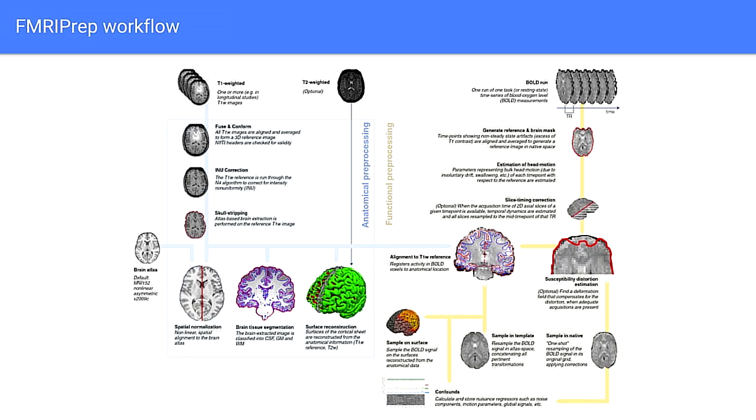Then just a quick comment about fMRIPrep and curating the data, which has some data that have been processed. fMRIPrep is a workflow to preprocess fMRI and also the corresponding anatomical information. It basically goes through different stages: on the left side we have the anatomical preprocessing, on the right-hand side we have the functional preprocessing, and the data go through several steps trying to ameliorate the problems of quality we've seen before. For example, inhomogeneity correction or slice timing correction for the functional data.